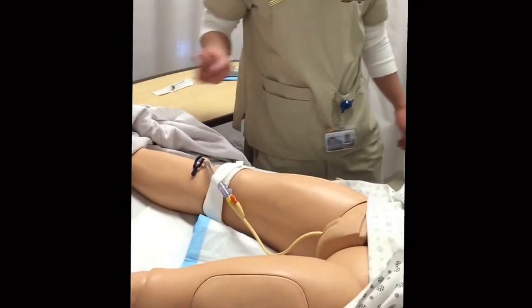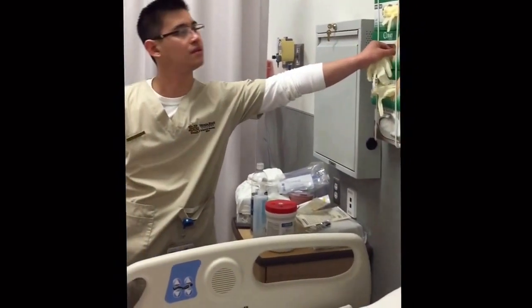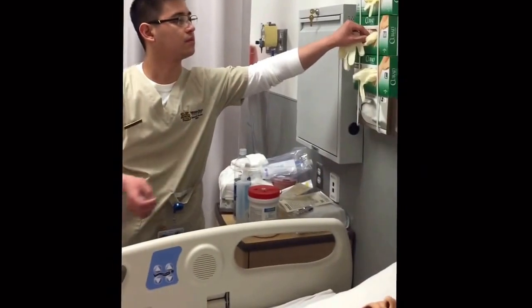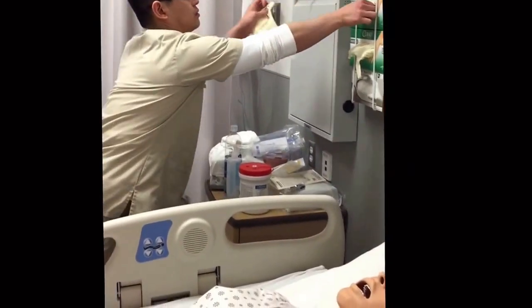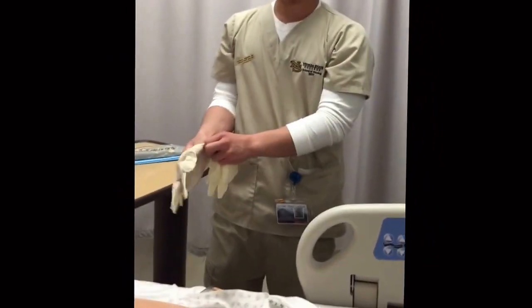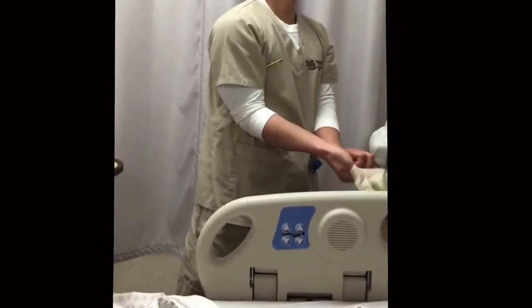Alright, make sure you put on gloves. You can use clean gloves for this. And make sure you assess the patient. Okay, I'll check the wristband.